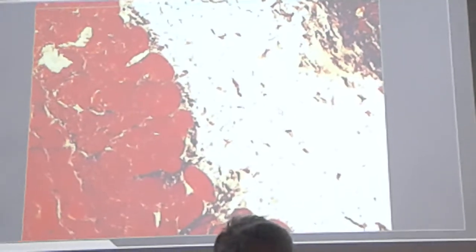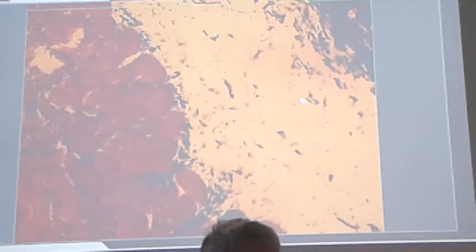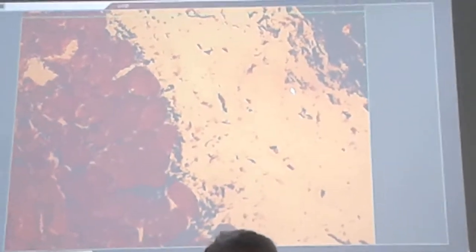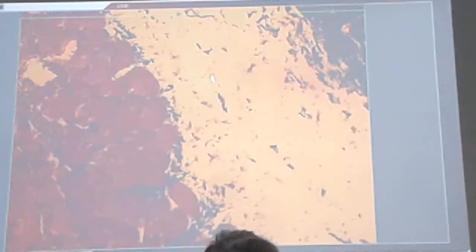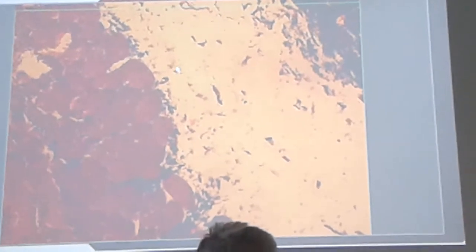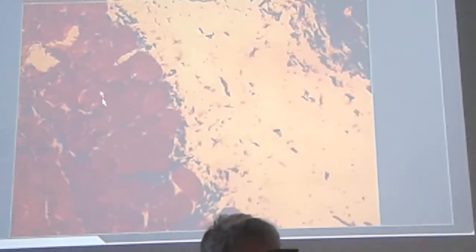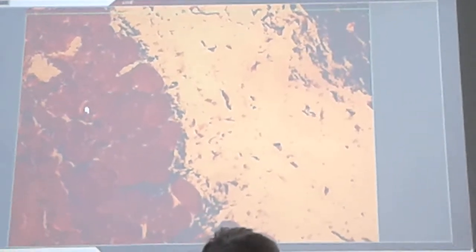Going back through the submucosa, it is a broad area with many fibers, many fibrous sheets, collagen bundles or elastic fibers. And then the next layer would be the tunica muscularis or tunica muscularis externa.